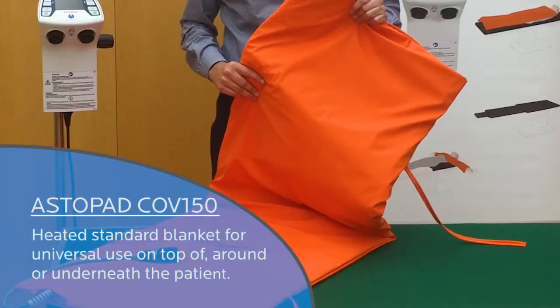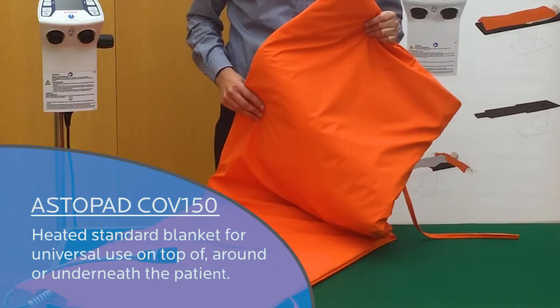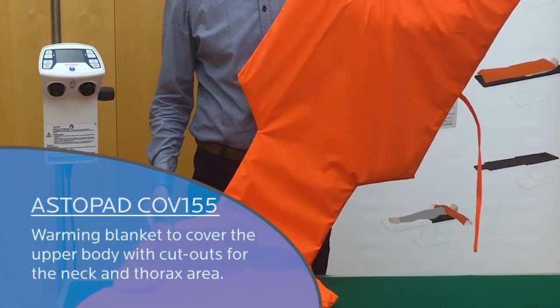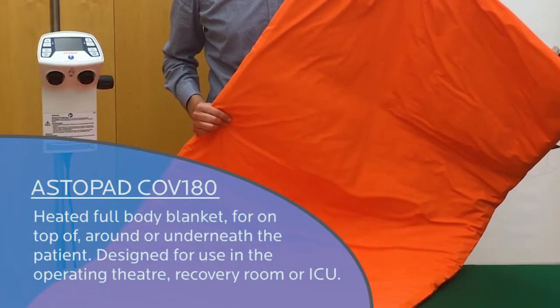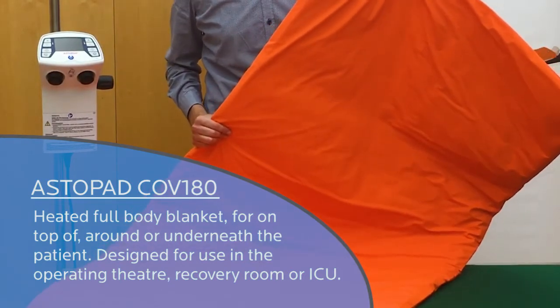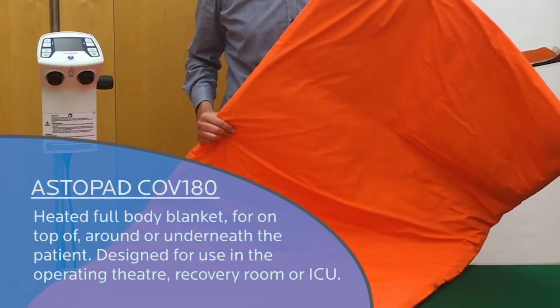The Astopad COV-150 is a standard heated blanket for universal use on top of, around, or underneath the patient. The COV-155 warming blanket is designed to cover the upper body with cut-outs for the neck and thorax area. The COV-180 is our full body blanket for use under, on top of, or around the patient — specially designed for the operating theater, recovery room, or intensive care unit.